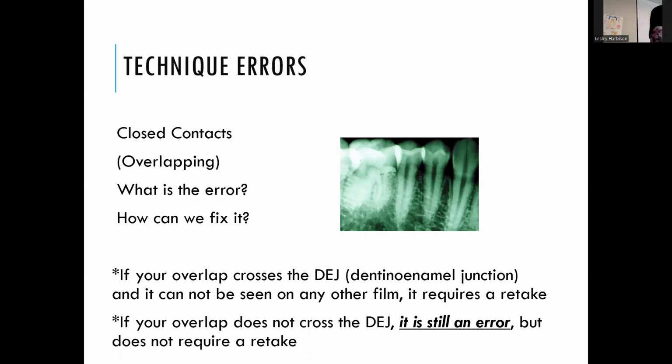So don't forget, until you've mastered that, always use your cotton swab. It might seem tedious and you might not have done it in private practice, but get in the habit of doing it here, because your instructor will say, why are these closed? And you'll say, I don't know. And they'll say, did you use the cotton swab? So you'll hear it. Just remember it through all of patient care.